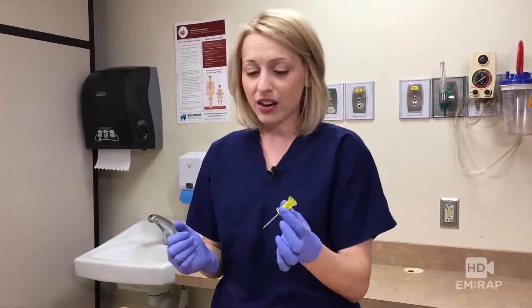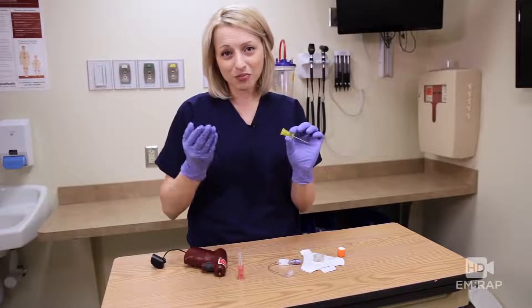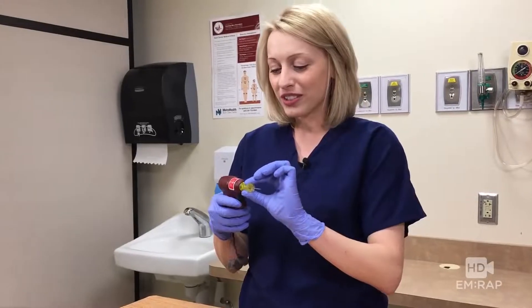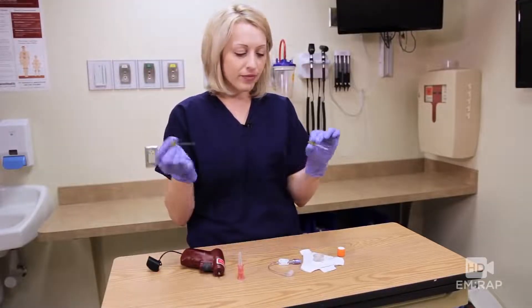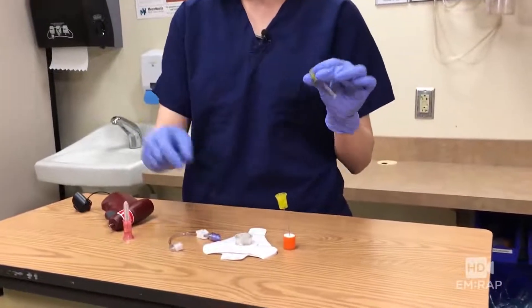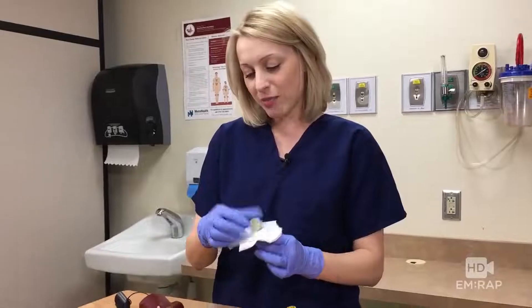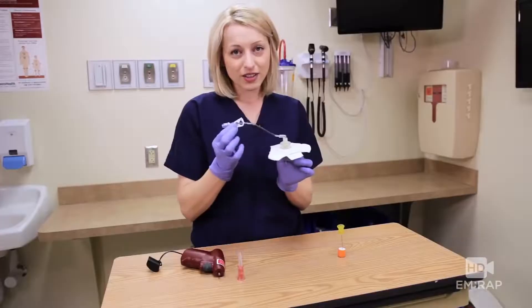And then yellow, which works well for the adult humerus and areas of adipose — so you can remember: yellow, adipose. You're welcome. It attaches magnetically to the drill, and once it's drilled into place, you're going to remove that stylet. Safety first. This proprietary dressing fits nicely over the top, and you can then connect your tubing. And you're all ready to go.